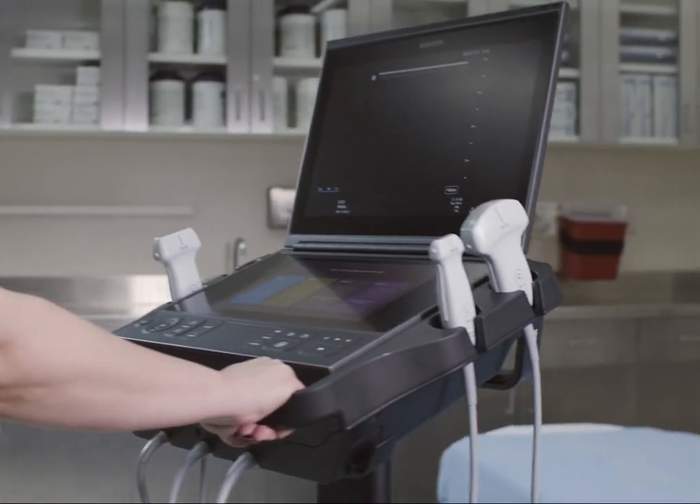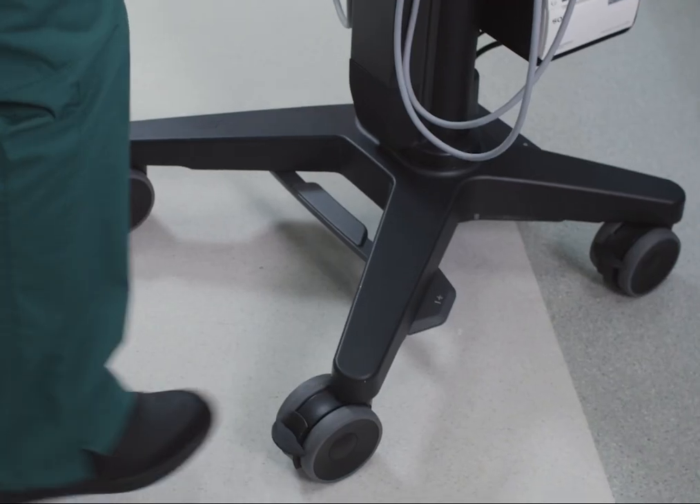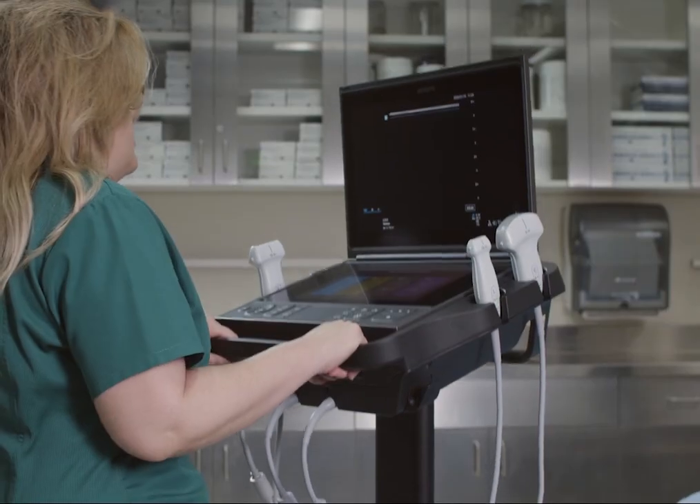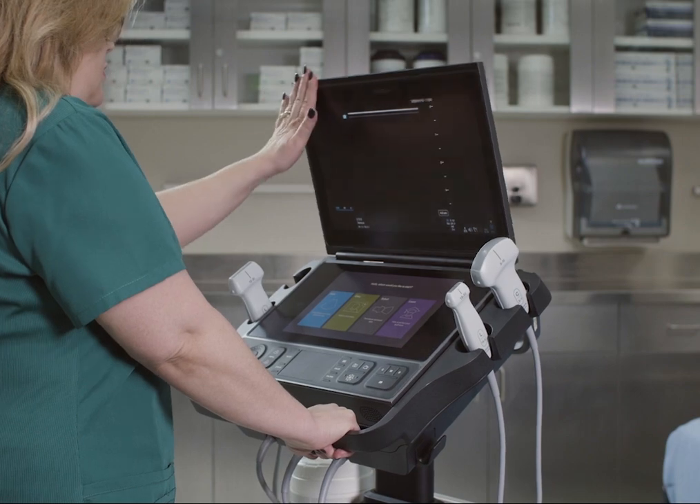Move the stand by pushing or pulling the handle. Adjust the height by stepping on the pedal and pulling up or pushing down on the platform. You can even change the angle of the platform.